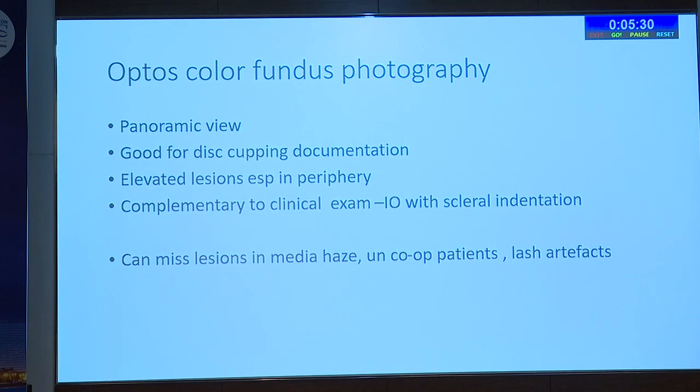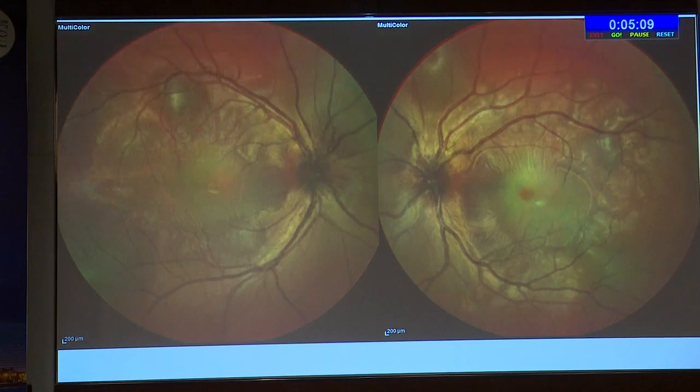And the most important thing is that it is complementary to your clinical examination, and indirect ophthalmoscopy with scleral indentation remains the gold standard to pick up everything. It can miss lesions in media haze, uncooperative patients and with lash artifacts. So if you don't see anything on the ultra wide field fundus photograph, it doesn't mean that the fundus is normal. You have to do your scleral indentation examination.